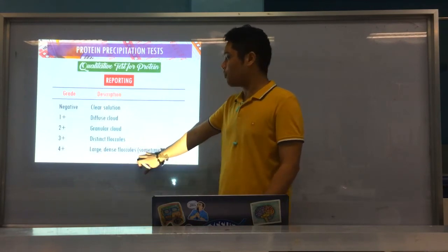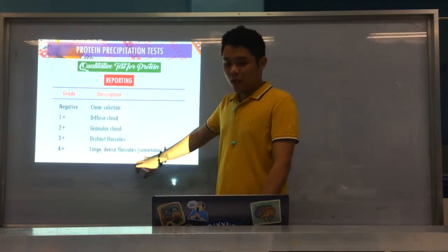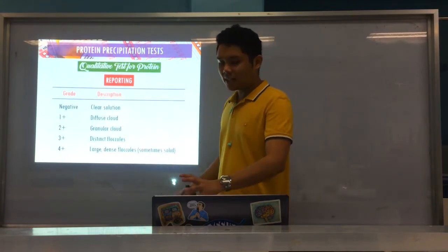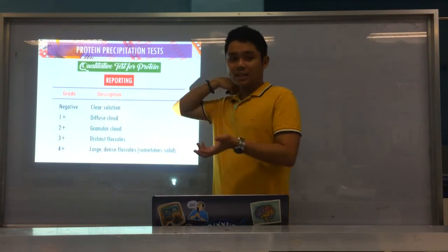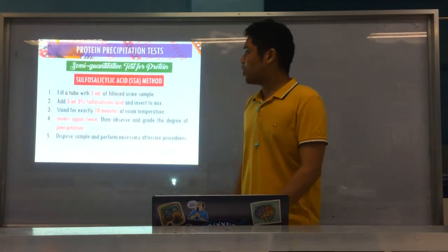Okay? Alright. So 4 plus. As you can see, of course, the solution becomes more turbid as you go to 4 plus. Okay? Alright. So those are the tests that need heat and acetic acid. And they are qualitative. Now we go to semi-quantitative.